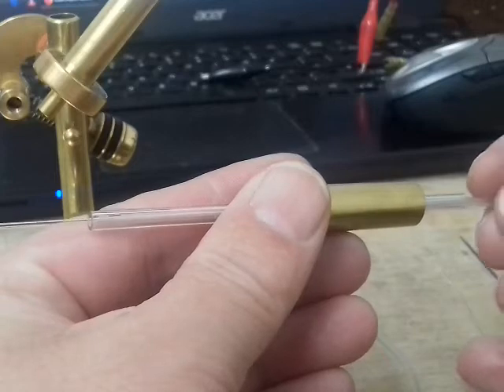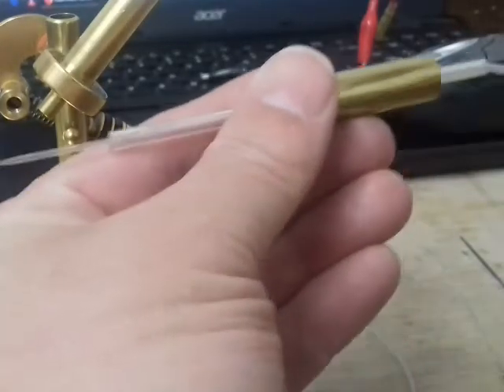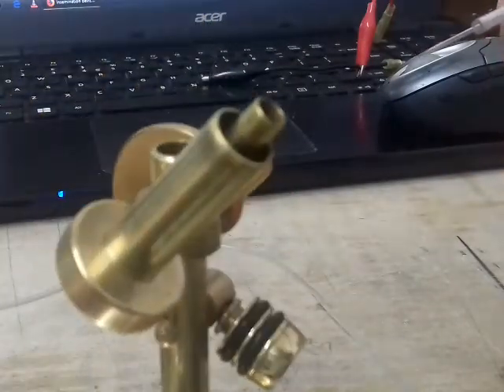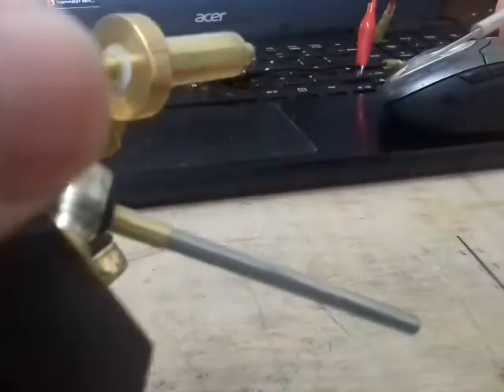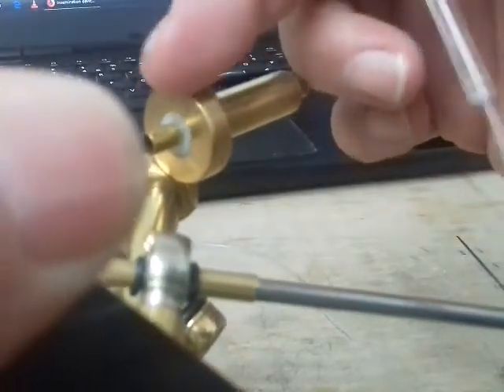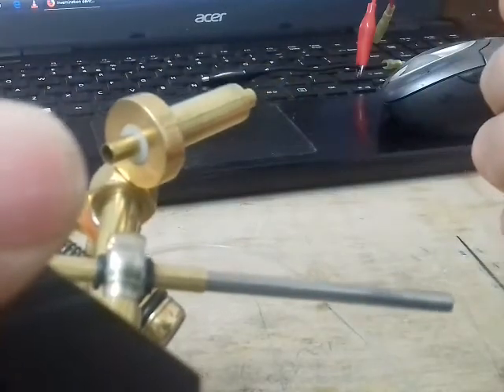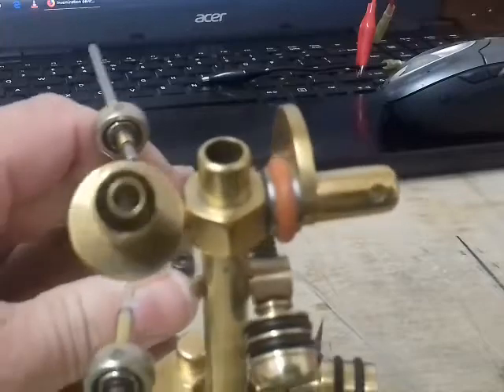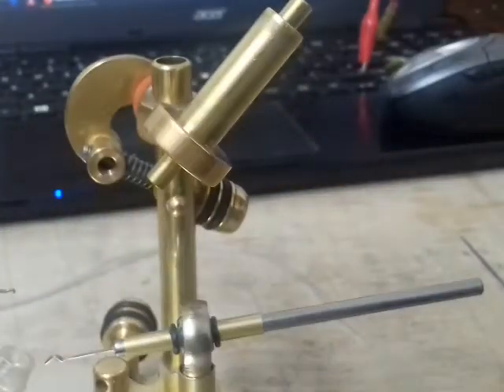That's just a nice semi-interference fit there, and that's the best way I've found. And on the unit itself you've got another tube inside that tube, and at the bottom I've got a nylon bush just here, you can see there, and that keeps that thing perfectly solid. It just won't move at all. If everything's centralised and kept as accurate as possible, it works so well.